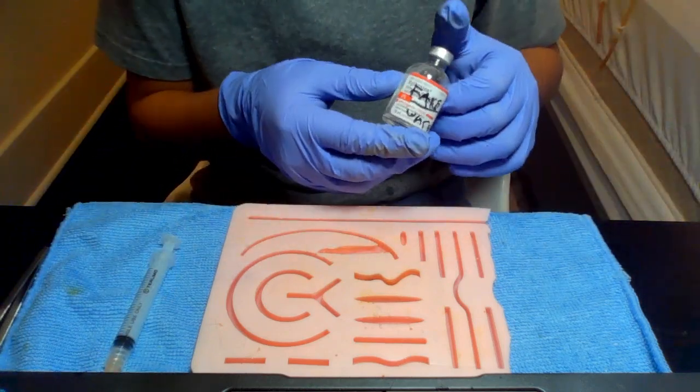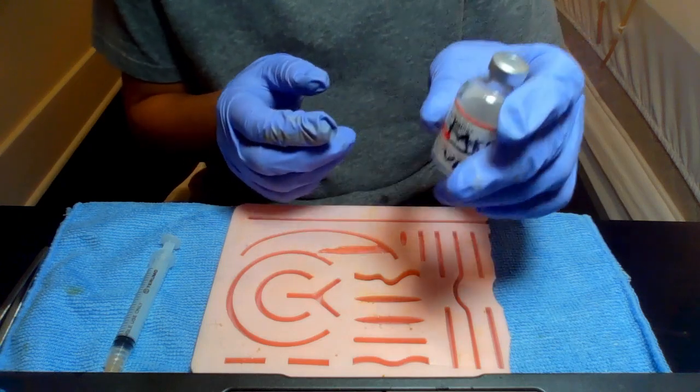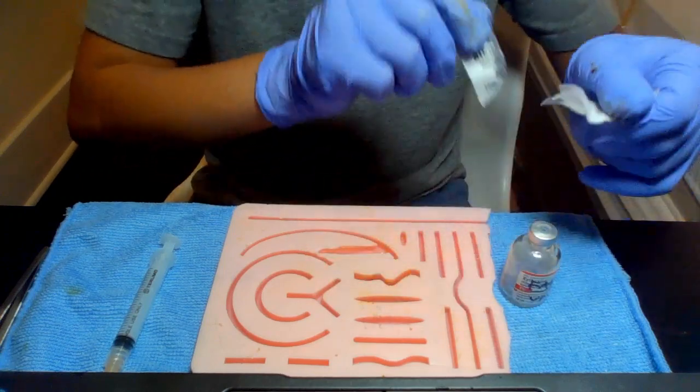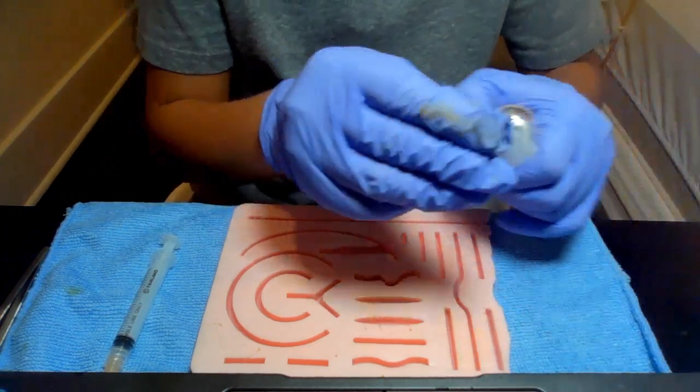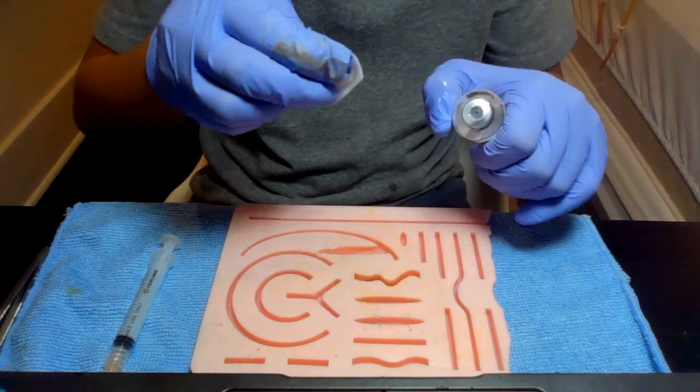Now, this is a fake vial that says fake water. Let's say we wanted to use lidocaine or something like that, which is what we would most likely use. What we're going to do is take our prep pad and clean the top of the vial. We're going to go one, and one, two.